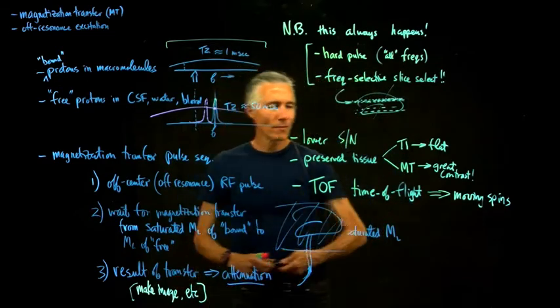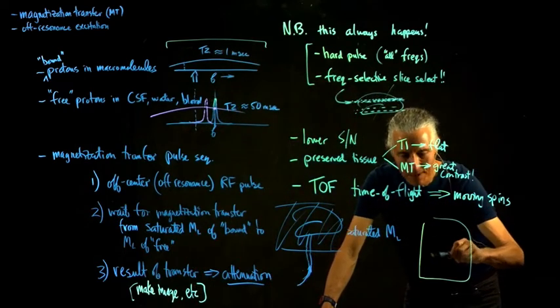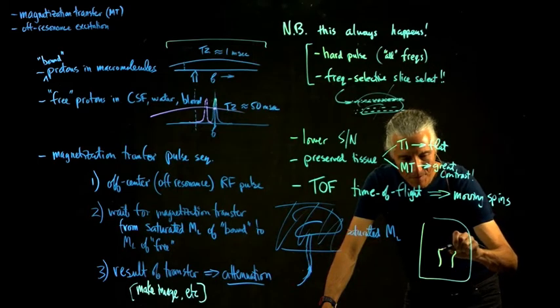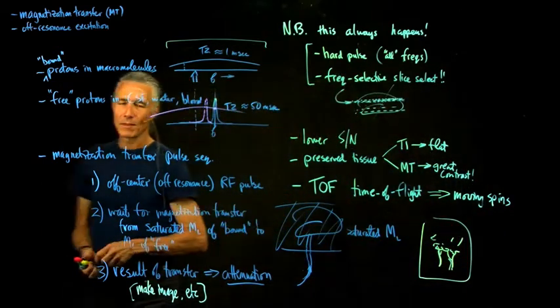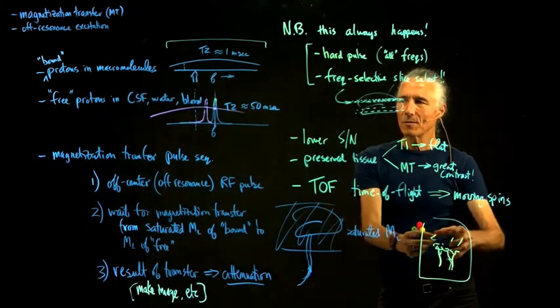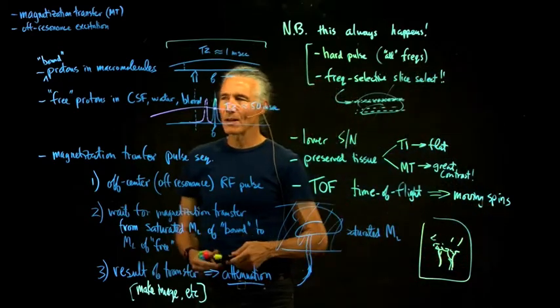If you've ever seen a picture that just looks like an angiogram, you can just see the carotid blood vessels like that, the circle of Willis. So you basically just see the blood vessels. And then you can animate this, to turn it around so you can see it in 3D. There's a very simple trick on how that animation is done.